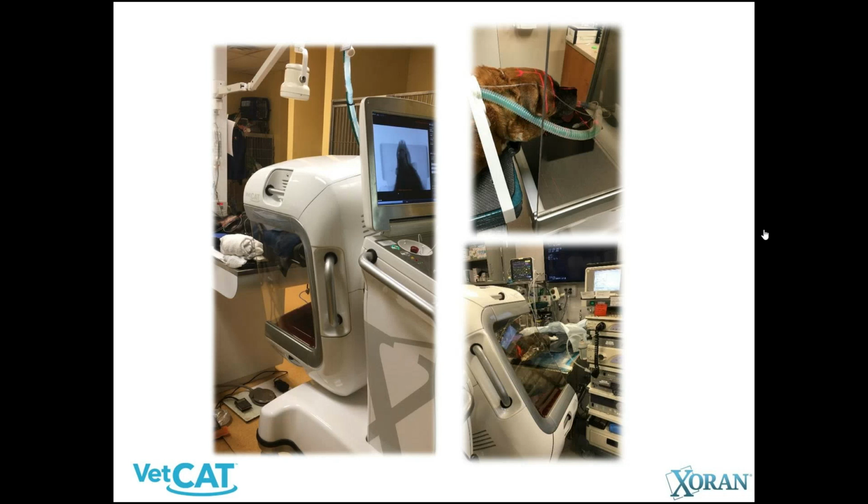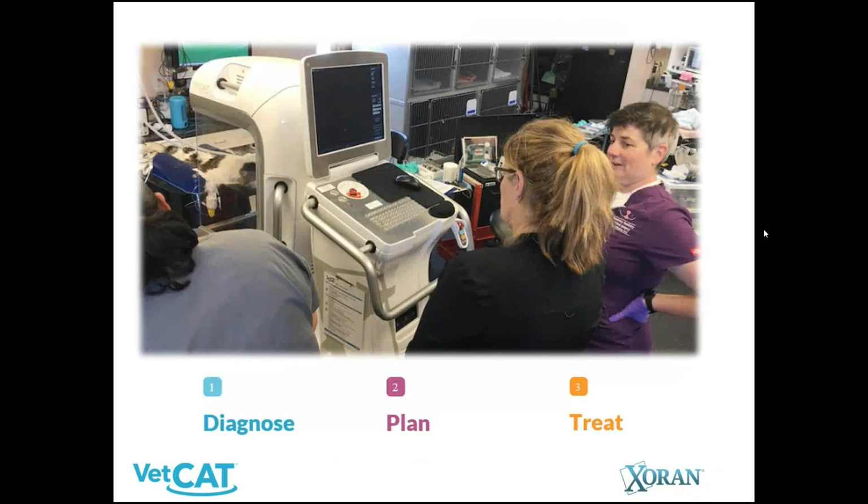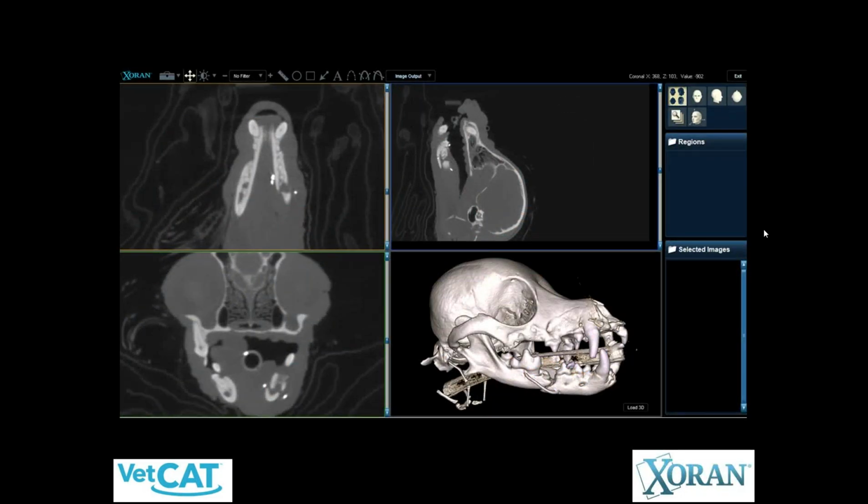This whole process takes about 30 seconds, and then the images are available on the computer screen within about a minute or so. And really the purpose of this cone beam CT is that it's available at the right place at the right time, allows you to quickly diagnose, plan your procedure, and treat with great precision.